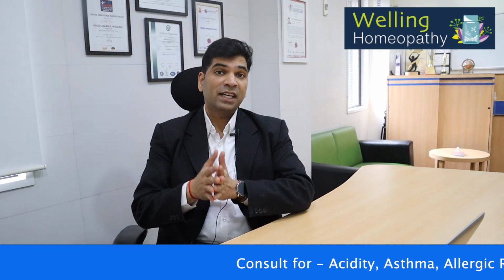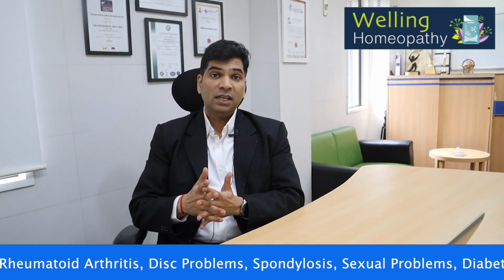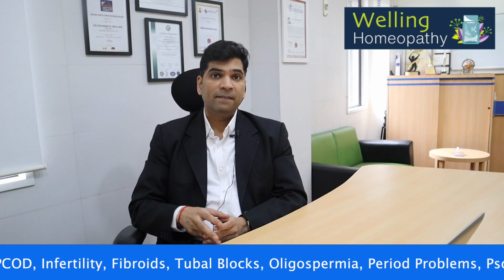An ovulation kit is very easy to use and helps you time sex even before ovulation happens. Timing for testing is more flexible, and some ladies prefer an ovulation kit rather than going to a doctor to check for ovulation. But sometimes it can get really expensive if you need to test repeatedly. Sometimes the result may not be clear and may not work if you have PCOS. And most importantly, it is not 100% accurate.